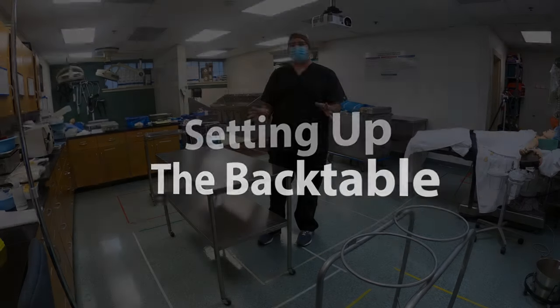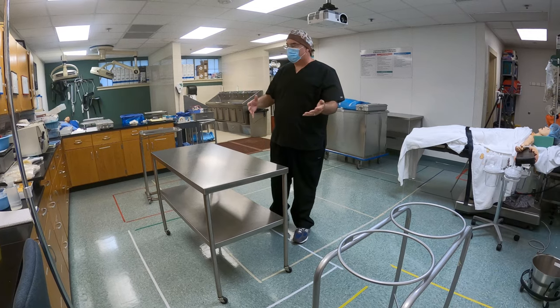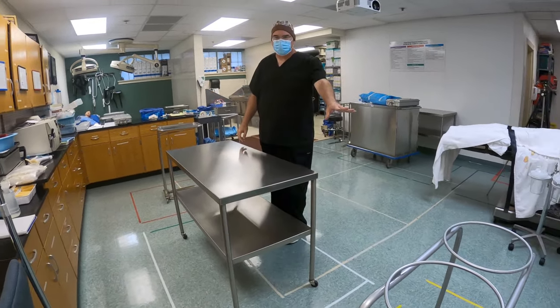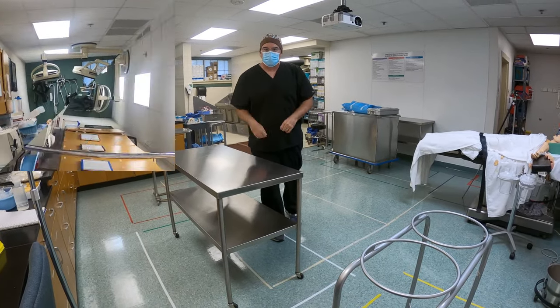Today we're going to learn how to set up our back table. The first step is getting all of the stuff together that we need — making sure we have everything: our back table, our Mayo stand, our ring stand, and everything else in the room — all the items you're going to have to check for before you actually set things up.